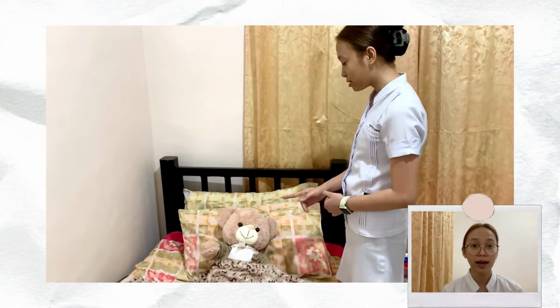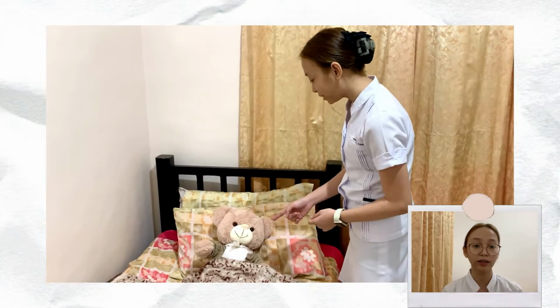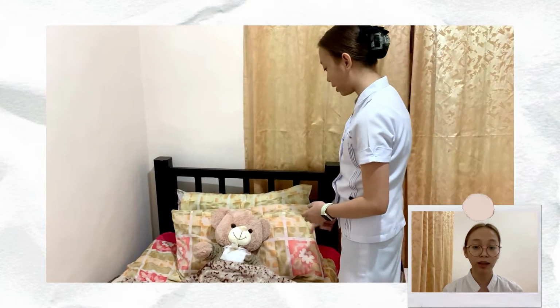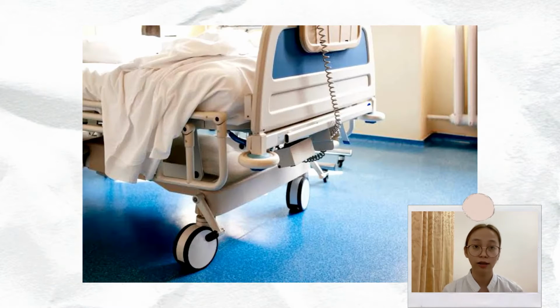Number 6, explain what you are going to do and the reason to the patient, even if the patient does not appear to be alert. Number 7, adjust bed to comfortable working position, usually elbow height of the caregiver, lower side rail closest to you.